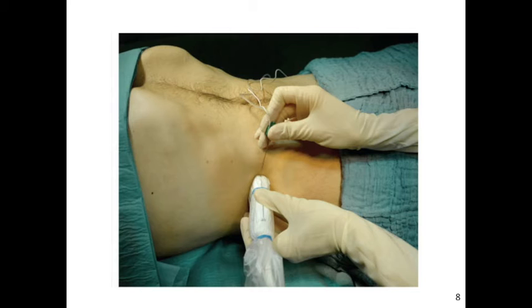Once the anatomy is identified, you can set up to perform the block. Also make sure that during your anatomic scan, you are looking for blood vessels that could lie in the trajectory of your needle path. There are a few different approaches to inserting the needle that are described in the anesthesia literature. Probably the most straightforward approach is the medial approach, which is shown here.